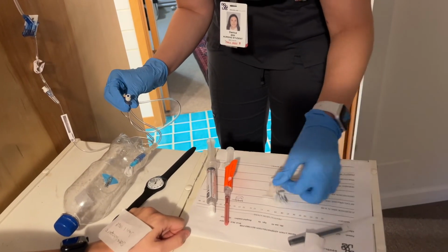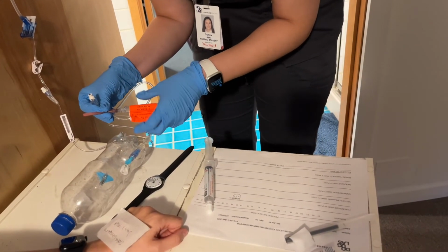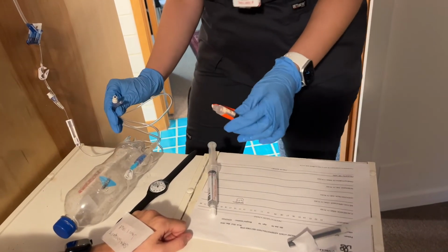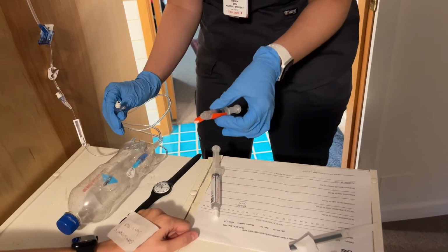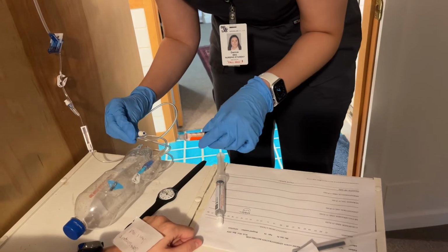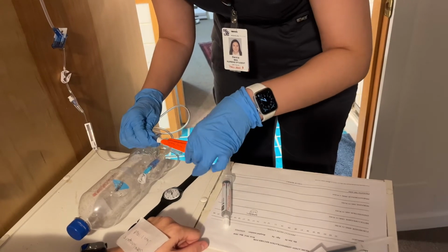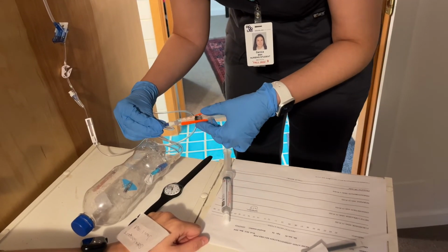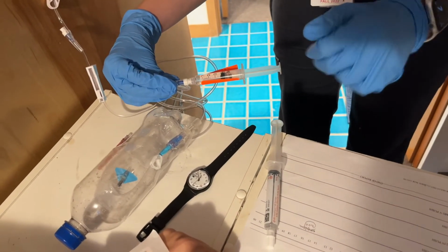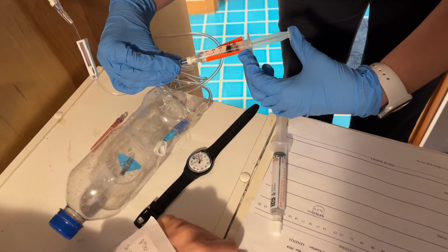Good. Now I'm just gonna get the medication. So we are administering 4 ml, so it's 1 ml per minute. So I will be using my little watch there to time myself. So I'll be putting this on, and I'm gonna get it to where I can see it, just so I know. And I'm gonna wait until it hits the 15, just so I know when to start my administration.